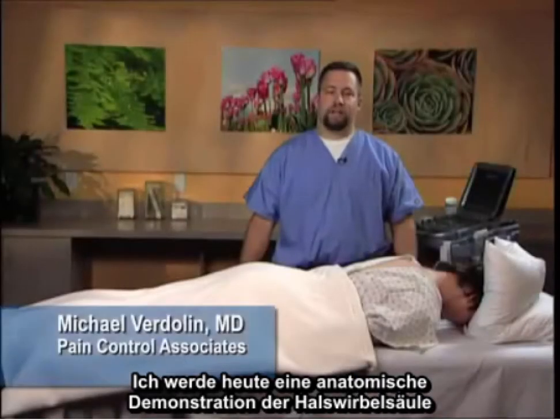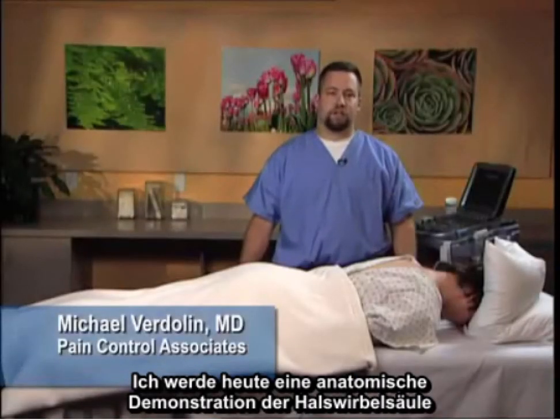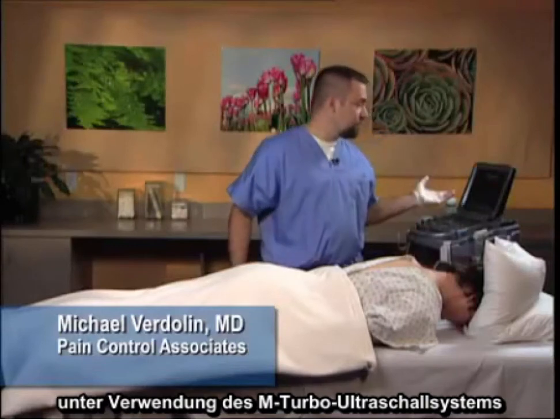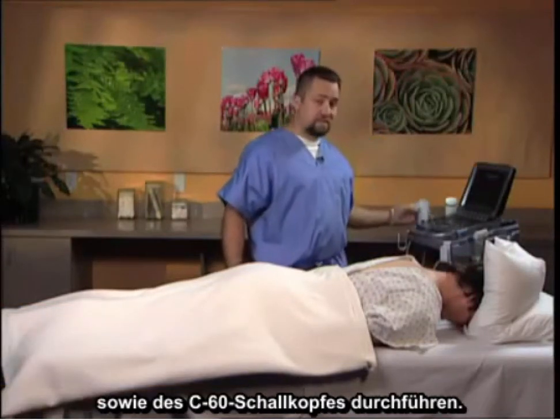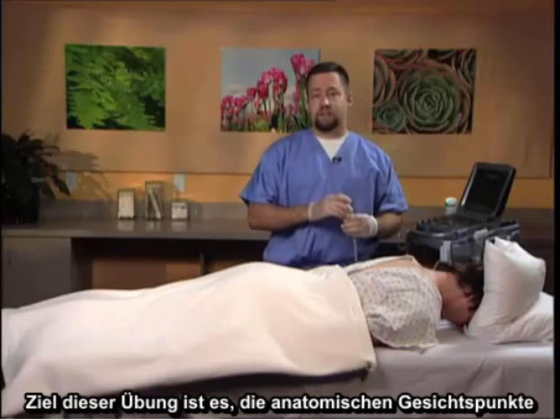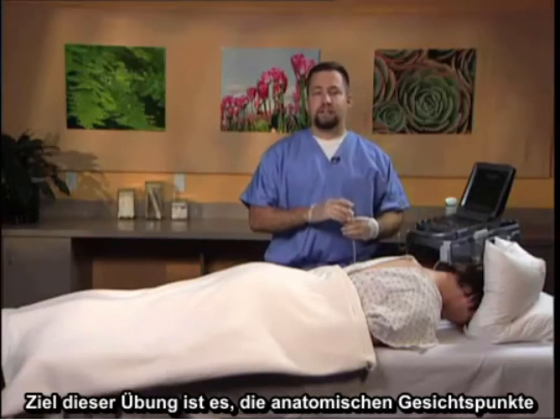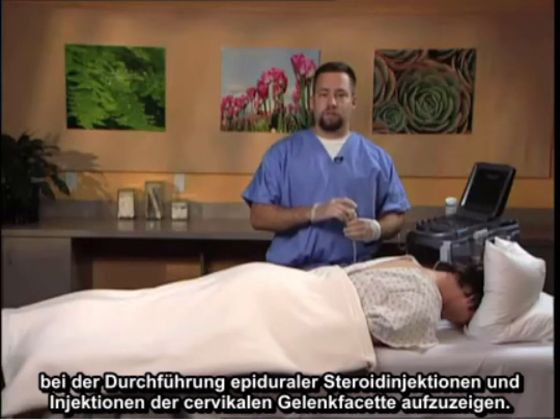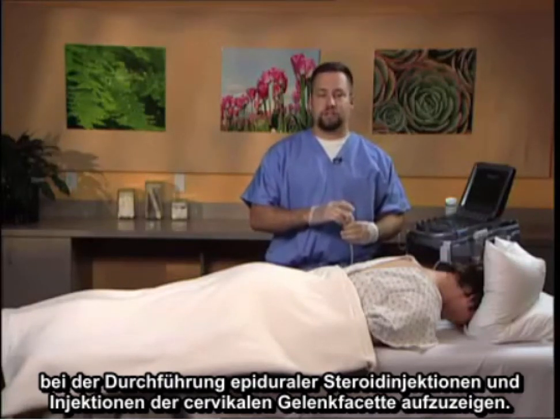Today I will perform an anatomic demonstration of the cervical spine utilizing the mTurbo ultrasound system with the C60 curvilinear probe. The point of this exercise is to demonstrate the anatomic considerations when performing cervical epidural steroid injections and cervical facet injections.